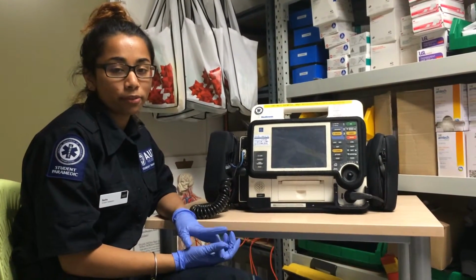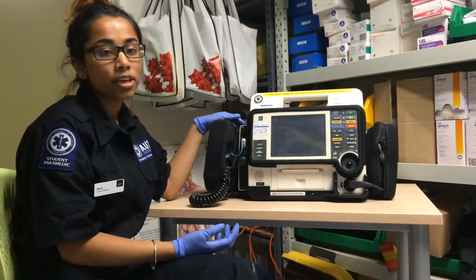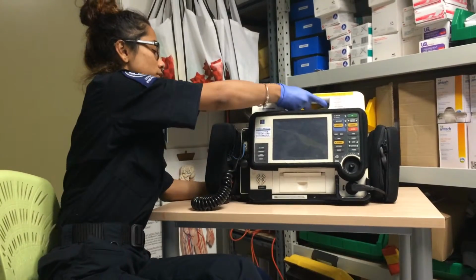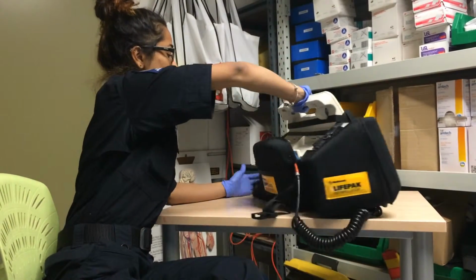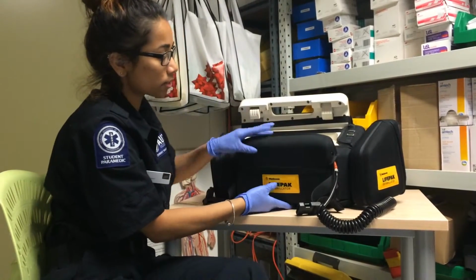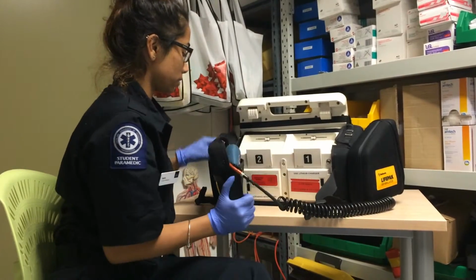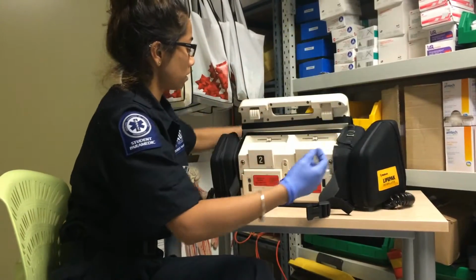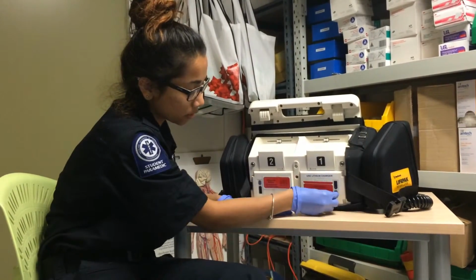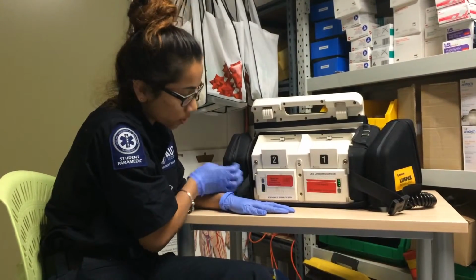Next, we're going to be doing a familiarization with the LifePak 12 ECG monitor and defibrillator. So before you start, you want to check the batteries, which are located on the back end of the machine. The batteries are located under this flap, so just take this off. So these are the batteries, and to check the charge on them, you want to click the grey button, and the lights will show you exactly how much charge is left in the batteries.